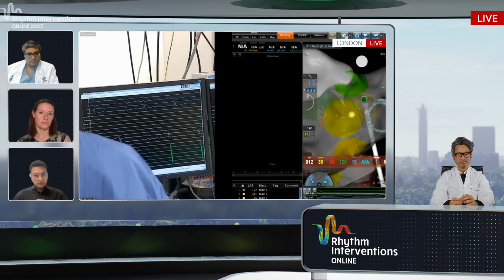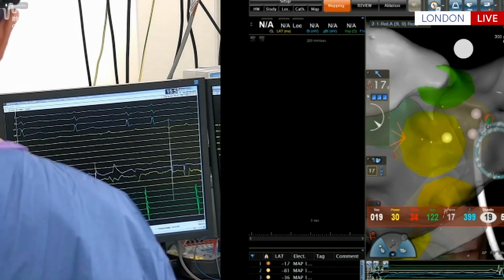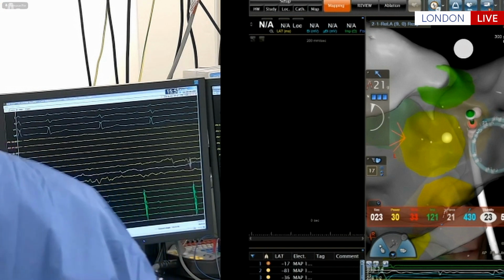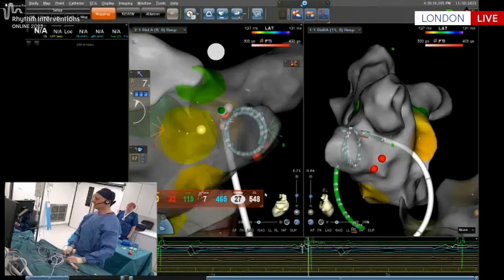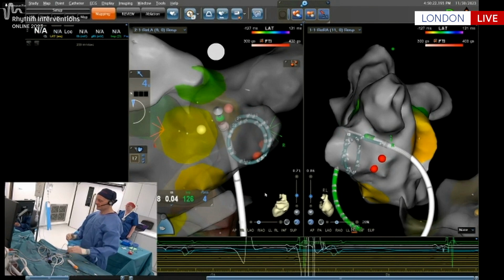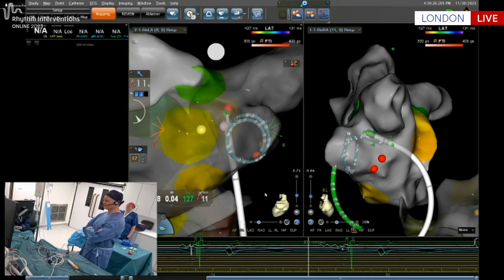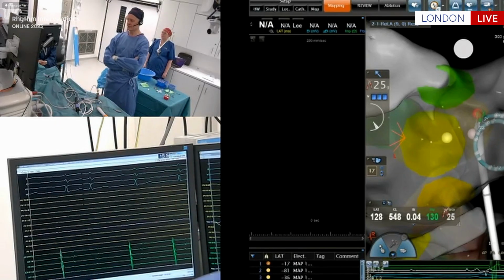Perfect. Wonderful. So I'm much more interested in the point at which it isolates and then how far lower it drops after that. Because I'll often move the balloon during the freeze to try and seal off the bottom end, as you do. And so I think the time to isolation isn't as useful as how much further it gets below the point at which it isolates, if that makes sense. So if I isolate at 40 and I go down to -50, I'm really happy.